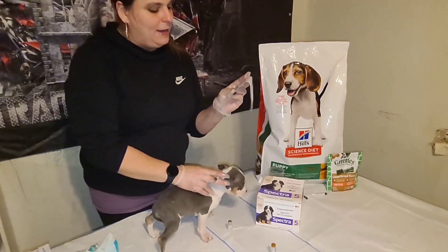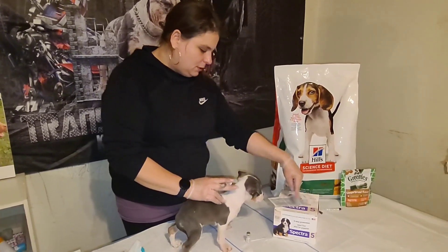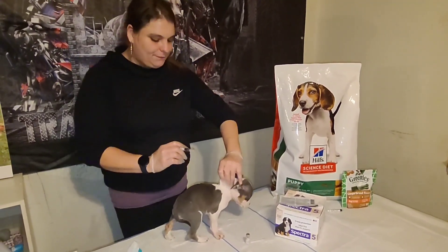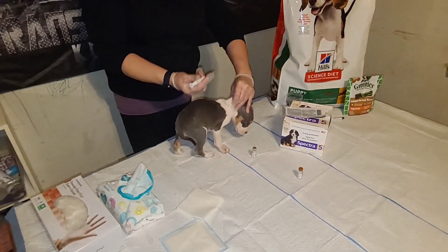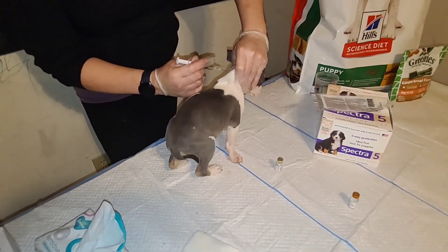The package even gives you little instructions — like the sites you can pick from and little tips. So again, when you get the needle in, pull back the plunger and aspirate for blood. If you see blood, pick a new site. If there's no blood, go ahead and administer the vaccine.